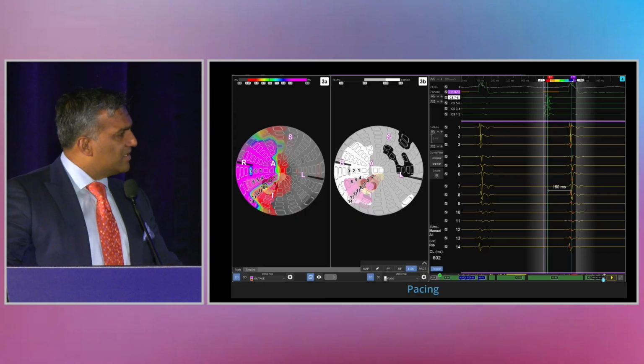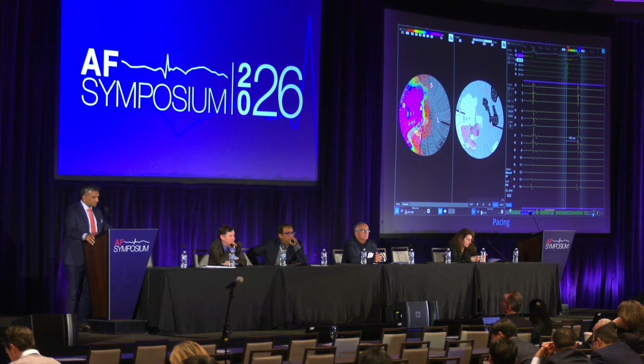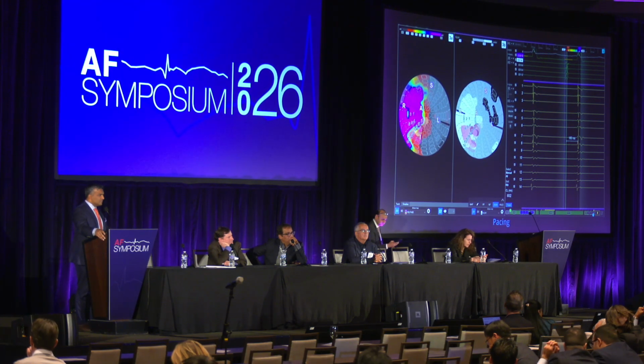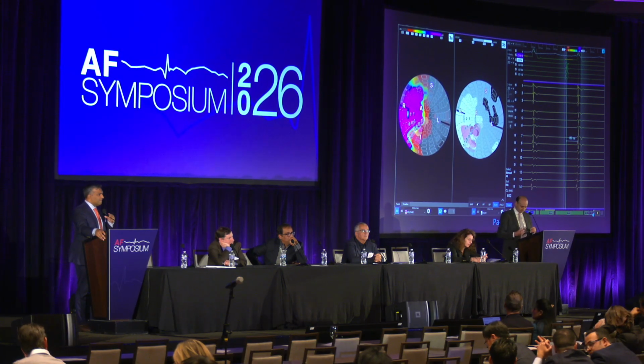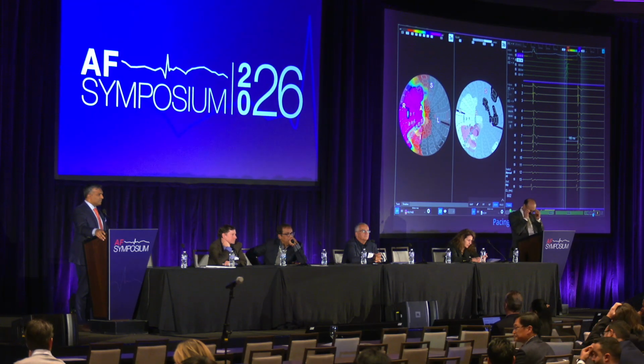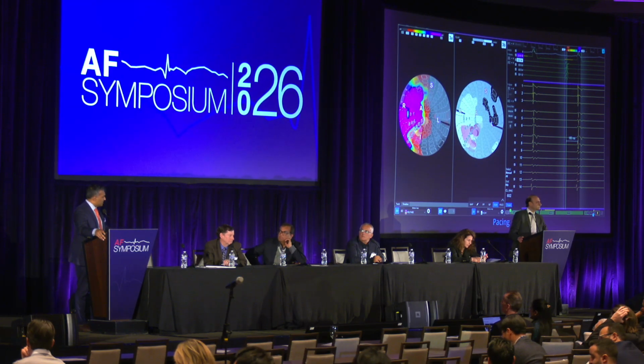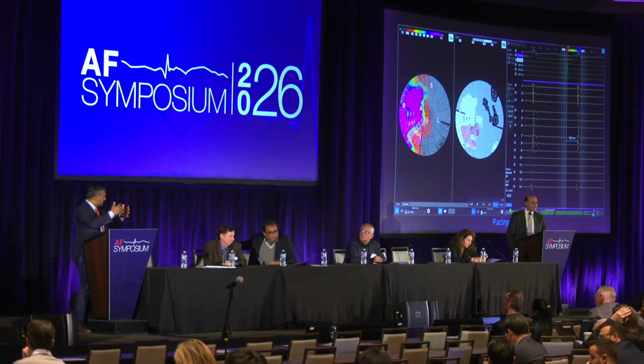Very nice. It is interesting that the majority of the patients were done in deep sedation. Yes, we are not using general anesthesia anymore, because of the stability of the catheter. The sphere is very robust, optically robust, and it stays there, even on the PV side, the mitral side, and the CTI. It's a very stable catheter. That's a very good point. Many of these cases, we don't have to use general anesthesia, and I think part of that is the directional ablation.